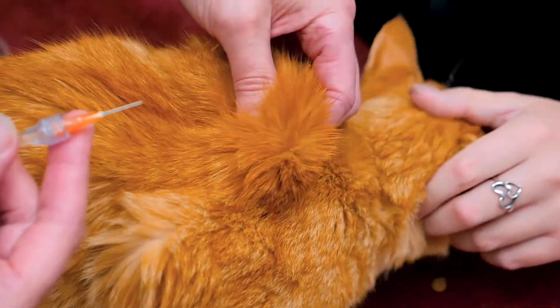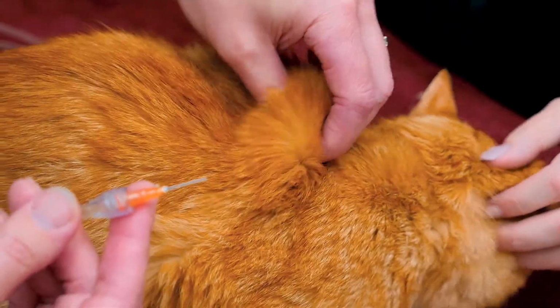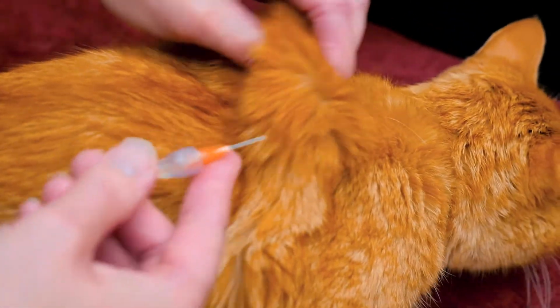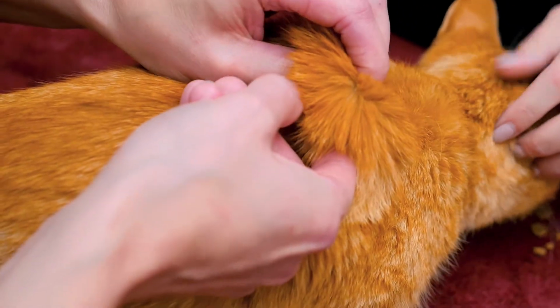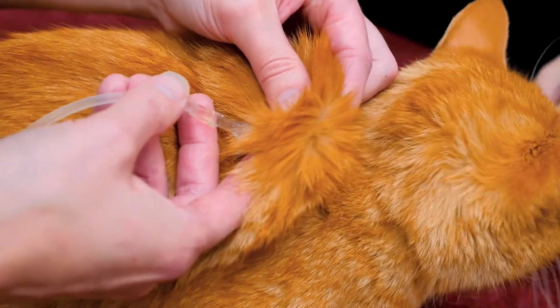I'm just creating a little bit of a tent with my fingers, so 4 fingers in the front, 1 thumb at the back. And you want to aim the needle so that it's just a little bit below your thumb. You do need to be careful you don't go straight through to the other side. You want to aim down just a little bit. And Hobbs didn't even notice when I put that in.